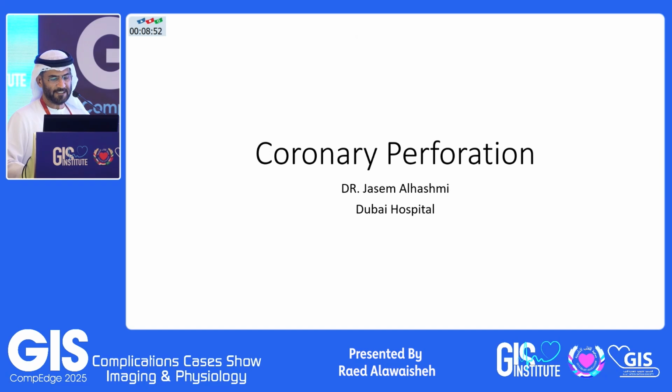Why am I presenting this case? We have so many cases of coronary perforation in Dubai Hospital, but why did I choose this case? Because I would like to talk about the operator part of the perforation rather than the perforation itself, and to have in your mind, first, patient safety. Your aim is to get the patient out of the cath lab in a safe situation.